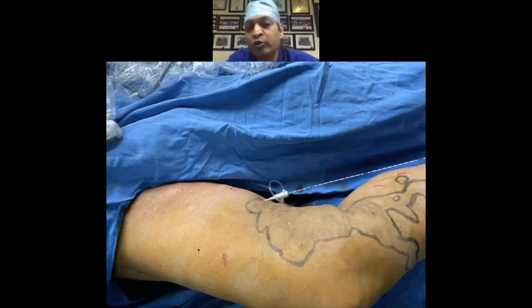The vein was around 22 millimeters in the proximal thigh, and in the mid thigh it has come out of the fascia, so the reflux has passed from the long saphenous vein into the superficial varicosities. So below this, the long saphenous vein is only maybe 1 to 2 millimeters. So I don't need to puncture that vein, and I can puncture the vein here in the mid thigh because I'm treating the refluxing long saphenous vein, and then I'm going to treat the varicosities.